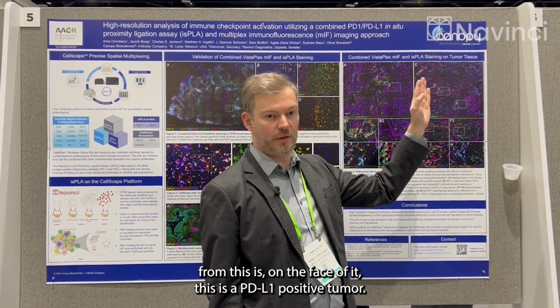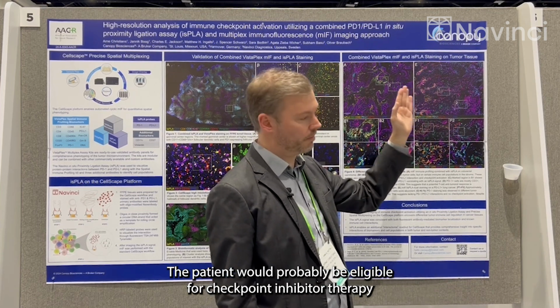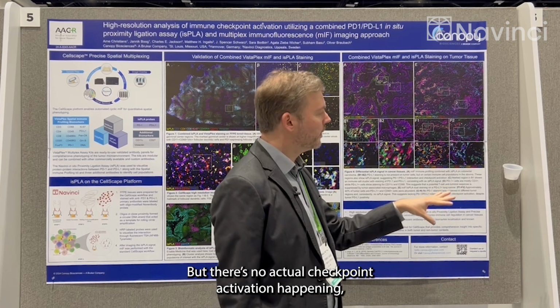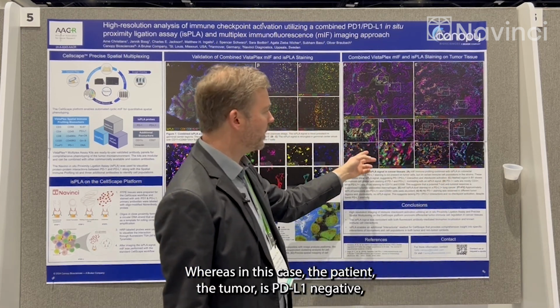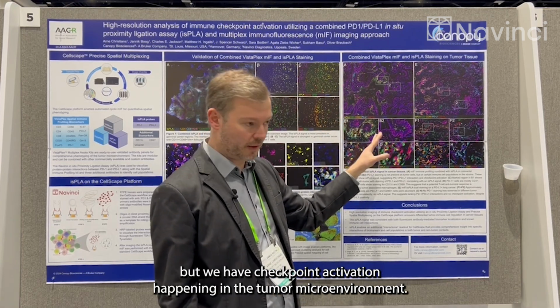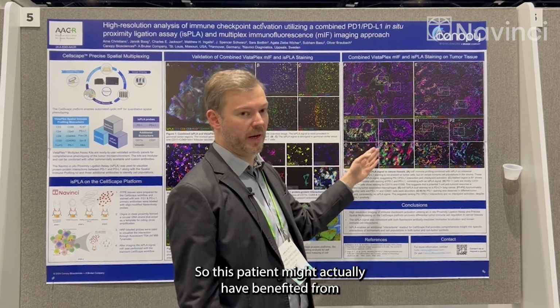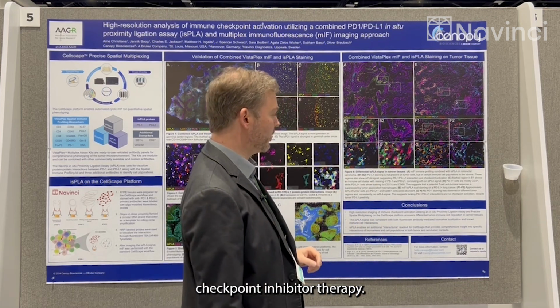So what we can garner from this is, on the face of it, this is a PD-L1 positive tumor. The patient would probably be eligible for checkpoint inhibitor therapy, but there's no actual checkpoint activation happening. So this would probably be a bad responder. Whereas in this case, the tumor is PD-L1 negative, but we have checkpoint activation happening in the tumor microenvironment. So this patient might actually have benefited from checkpoint inhibitor therapy.